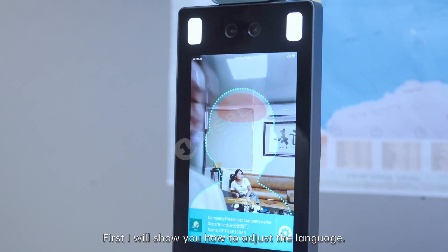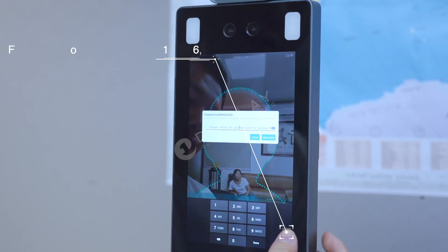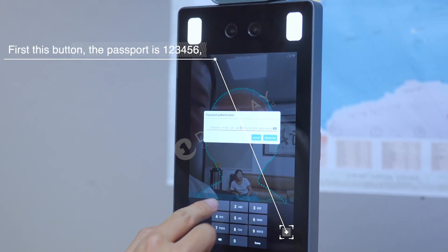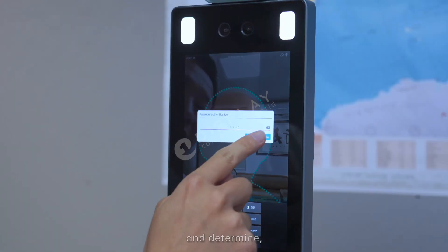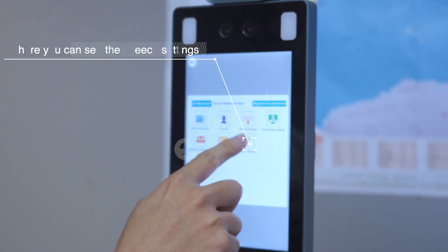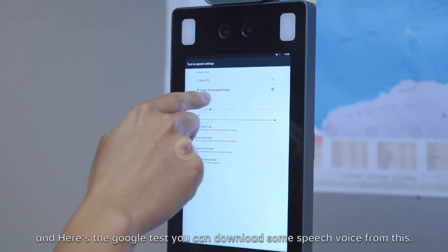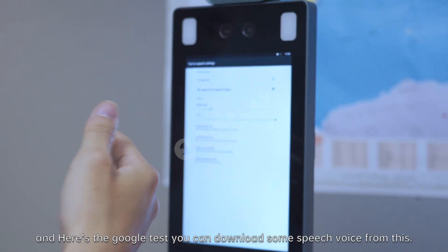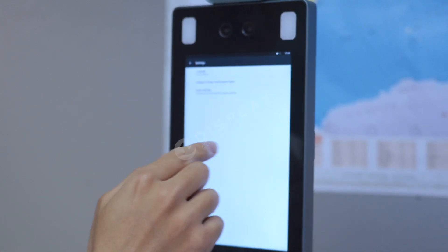First I will show you how to operate and adjust the language. Press this button and enter the password 123456 and confirm. Here you can see the speech settings. Press it to set up. And here is the Google TTS test — you can download some speech voice from Google.